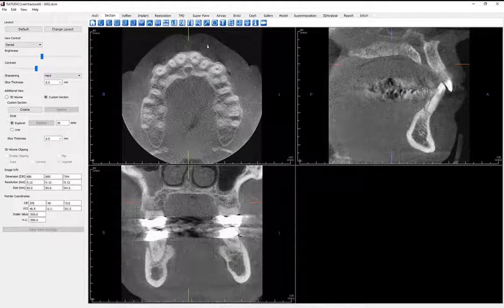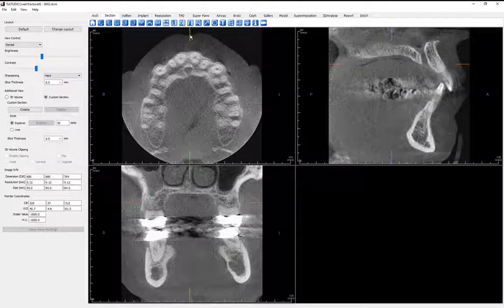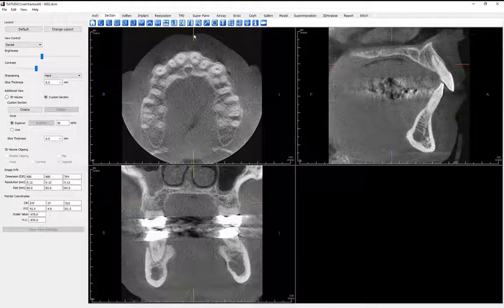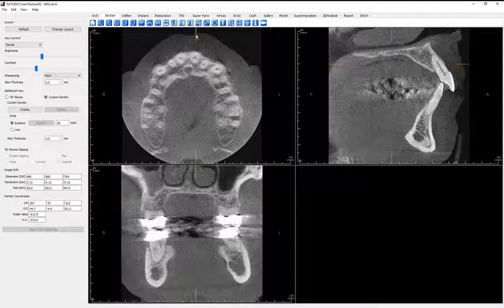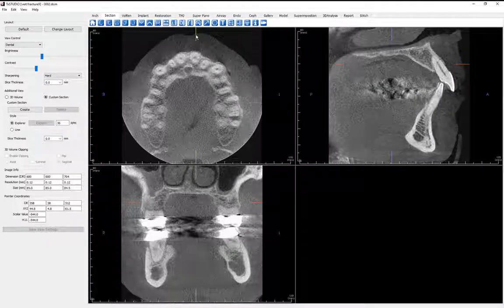Next, let's mouse click on the green vertical cursor line and drag the mouse so that the line intersects the fracture. In the sagittal view window, we should now see the fracture.